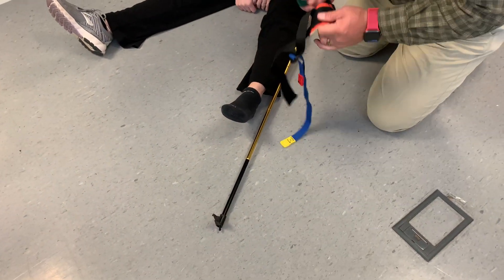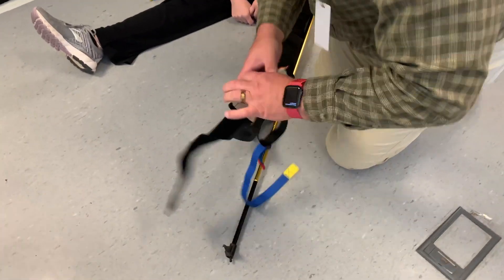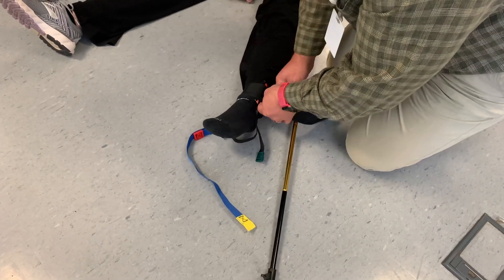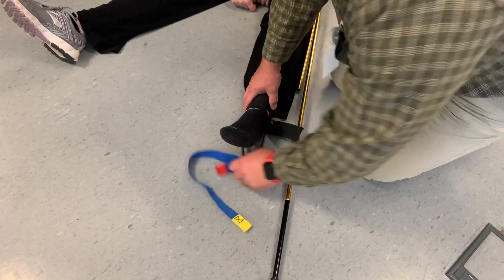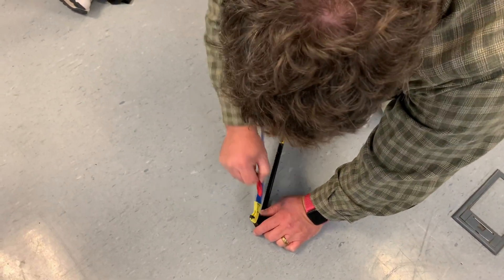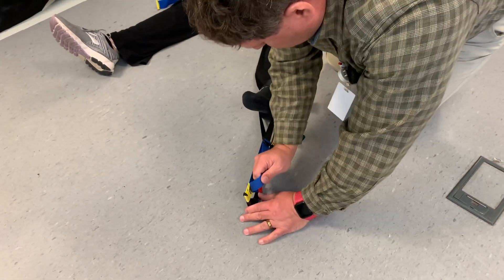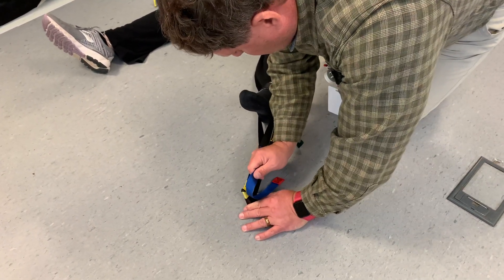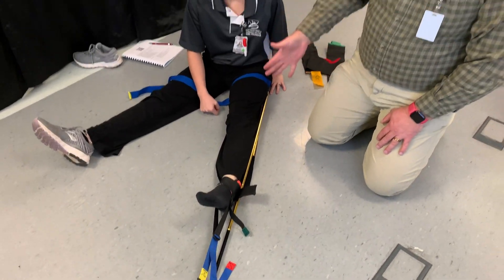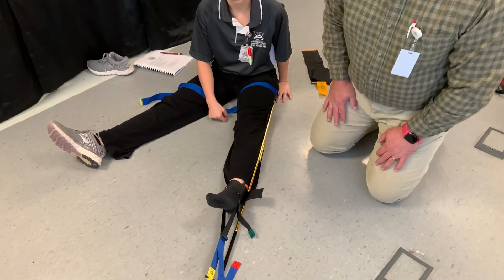We have the ankle hitch, which is just going to go around the ankle. The yellow part clips over that, and then I can pull the red to provide the traction, and then that stretches the leg. When there's pain relief or the limb is the same length, we can stop and then reassess circulation, sensory, and motor function.